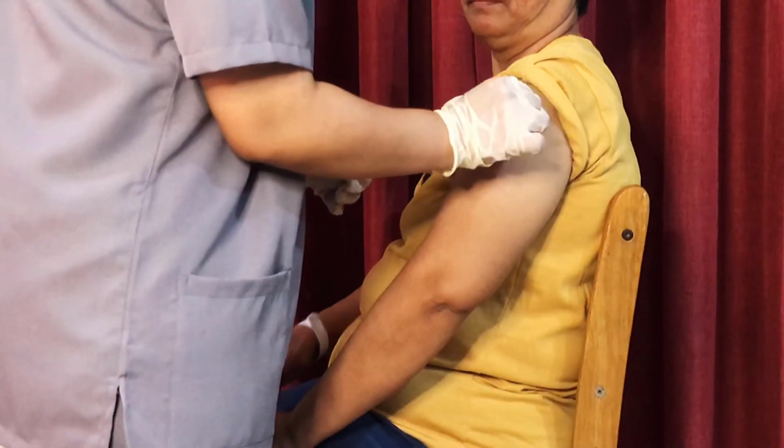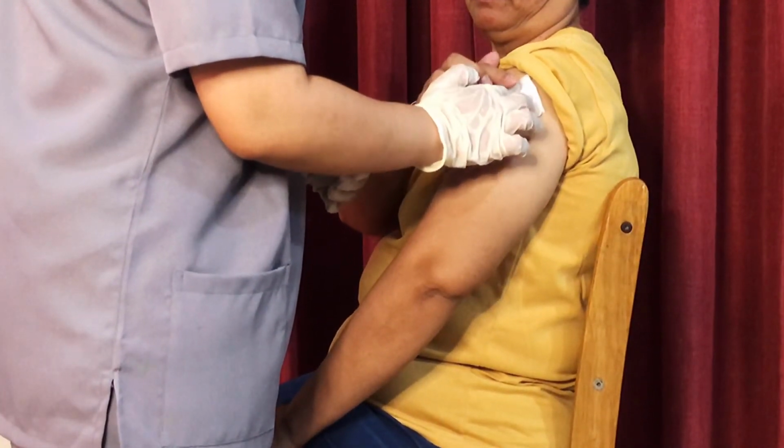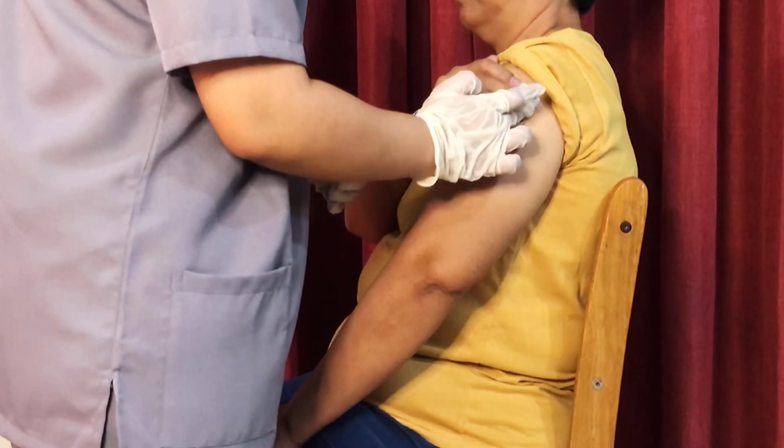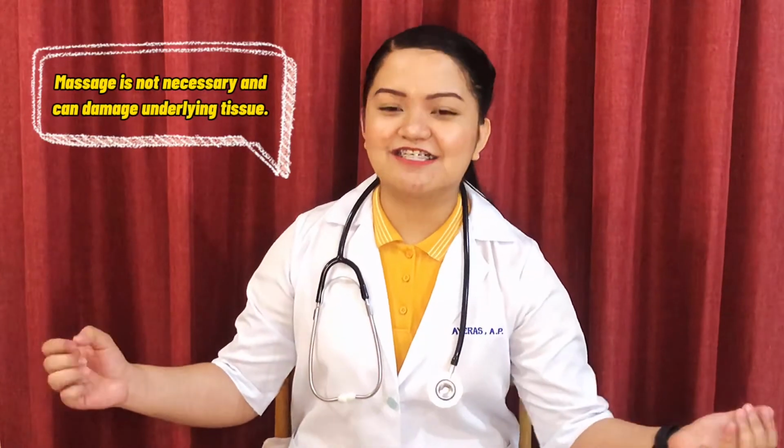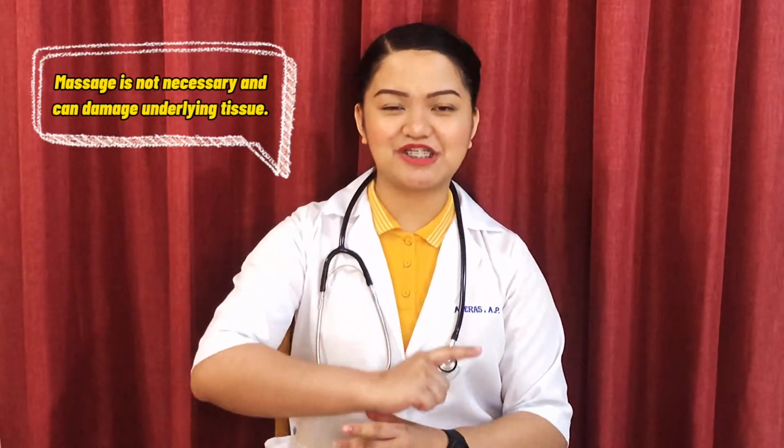Do not massage the site after an IM or intramuscular injection because it can cause damage to the underlying tissue. Using a sterile gauze, apply gentle pressure at the site after the needle is withdrawn and do not massage the site. Massage is not necessary and can damage underlying tissue. Massaging after a heparin injection can contribute to the formation of a hematoma.